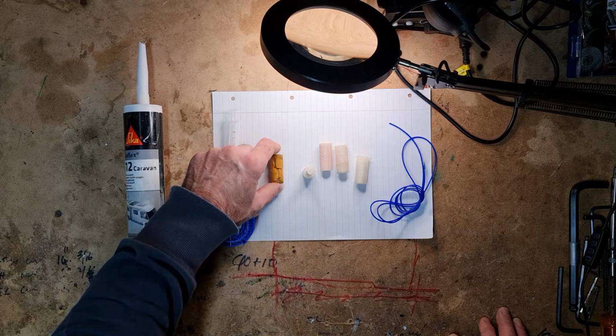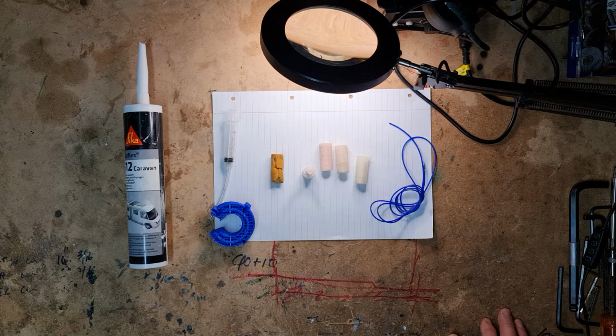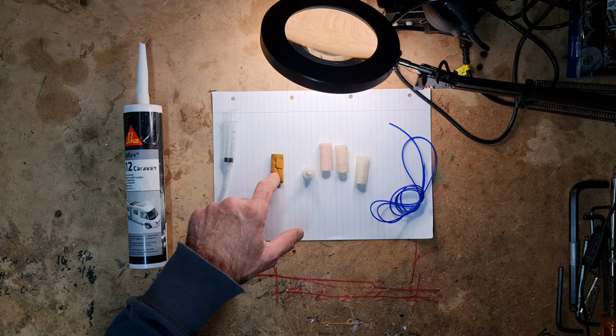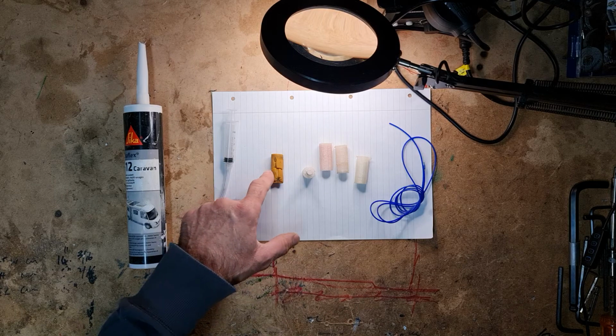This is a central core suspension unit for a lower limb prosthetic leg unit. Basically the leg unit goes into the foot, and this particular unit gives sideways, horizontal and vertical suspension for the amputee user. The suspension basically consists of a very simple motorbike type or even bike type suspension plunger unit, and inside there's no actual spring. Inside relies on this unit here.